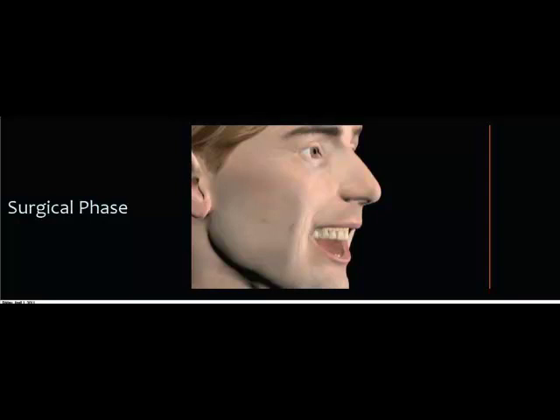Very important when you're preparing the osteotomies is to get the feel of the bone when you're drilling, because the drilling protocol will change from patient to patient, where it might even include the tapping of the sites, especially when longer implants are being placed.